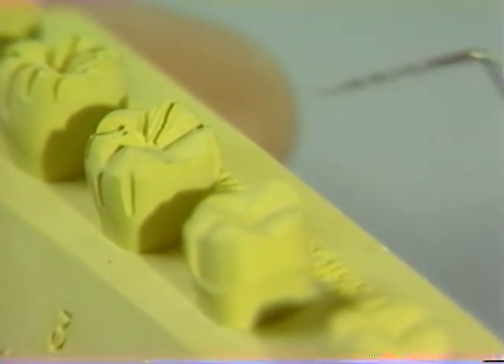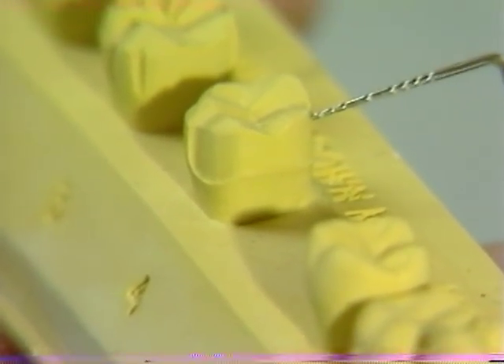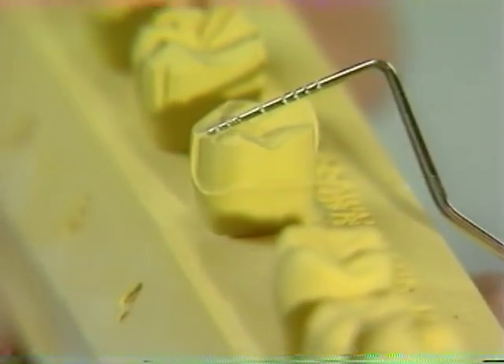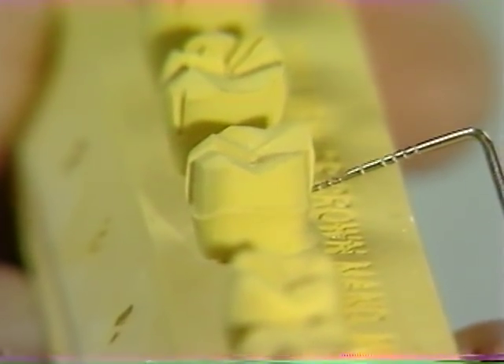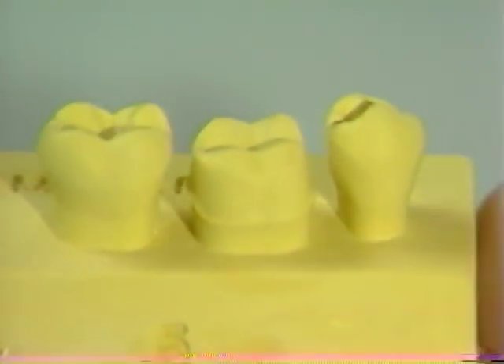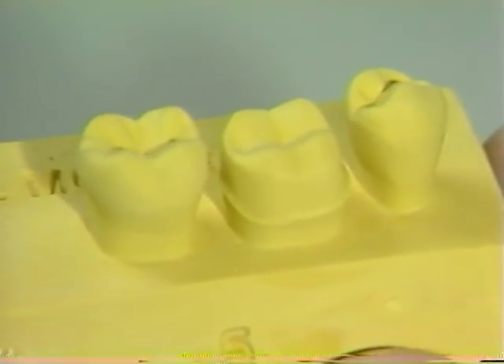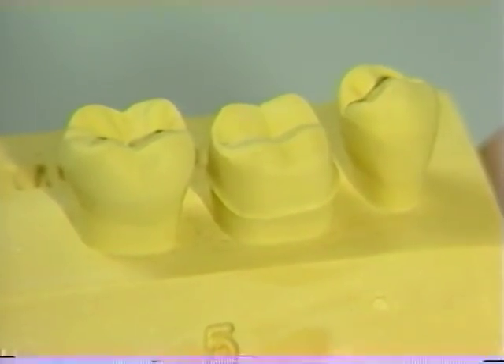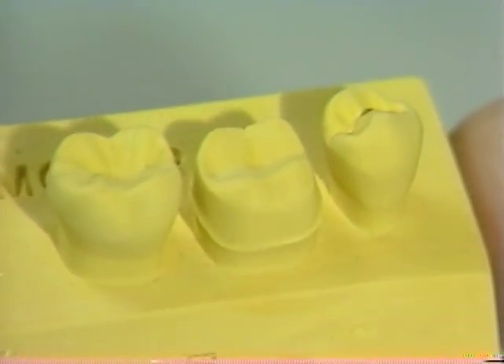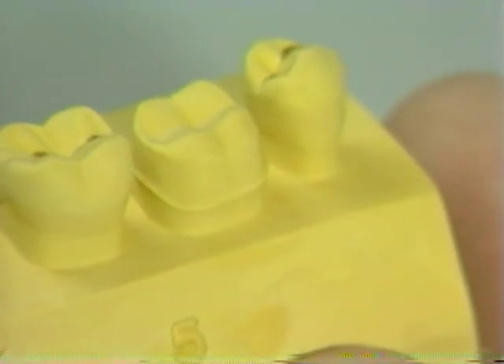After the occlusal reduction has been completed, we will then proceed with the axial reduction of the tooth — again, half a tooth at a time, maintaining the other half for reference. Once satisfied with this half of the axial reduction, the tooth preparation is then completed and finished, which includes smoothing of all surfaces, delineation of the chamfer margin, and rounding of all pertinent line angles.